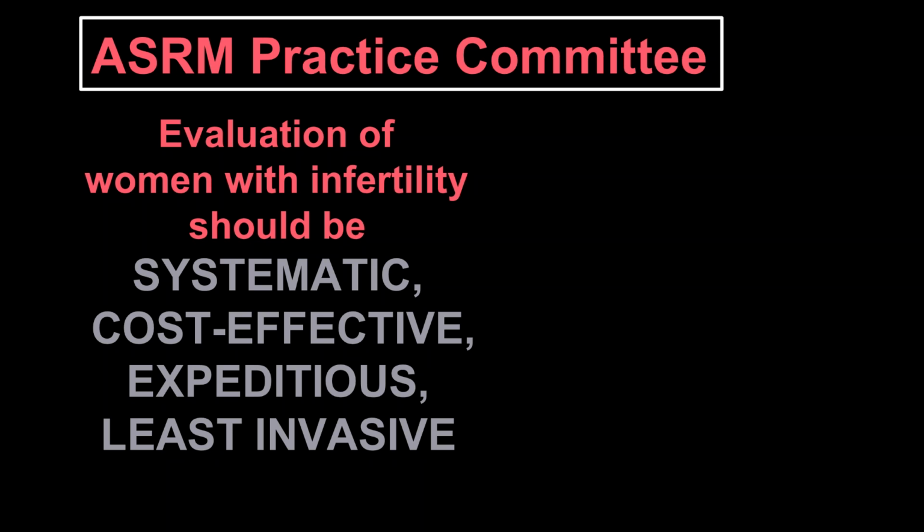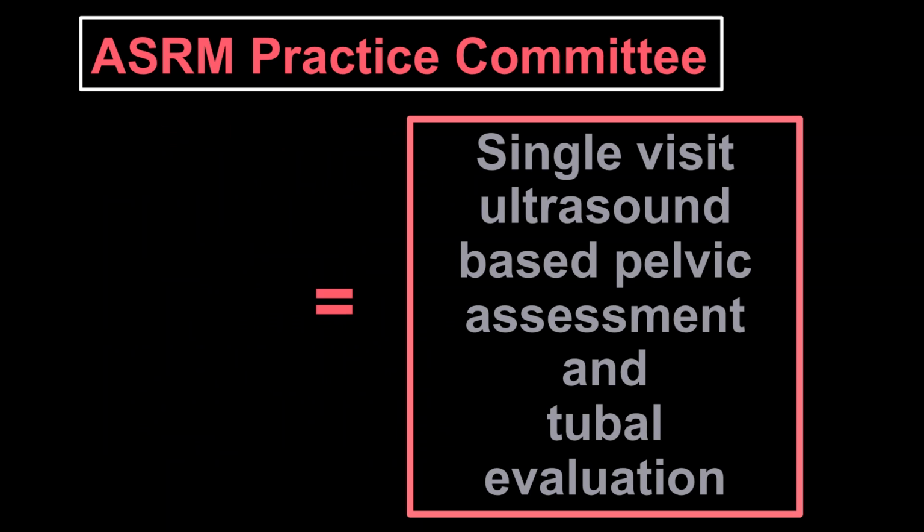So to conclude, when we started, we discussed the ASRM practice committee opinion, which basically said evaluation of women with infertility should be systematic, cost-effective, expeditious, and least invasive. And hopefully I've proven to you that single-visit ultrasound-based pelvic assessment and tubal evaluation is the way to achieve this. Thank you.